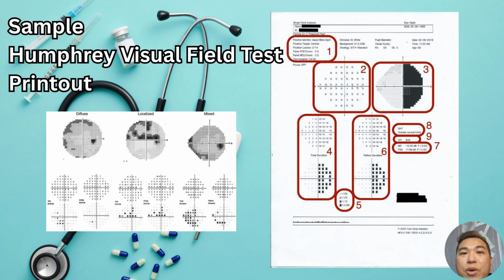Total deviation plot shows difference from age-matched normal values. Probability plot highlights areas with statistically significant loss. Pattern deviation plot adjusts for overall depression, like cataracts, to reveal localized defects.